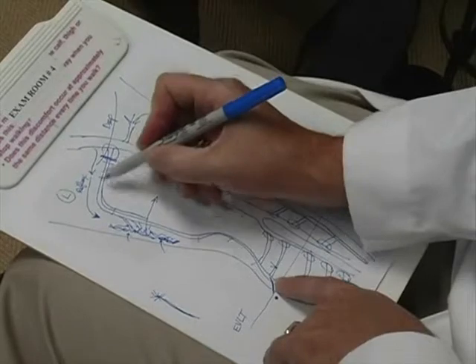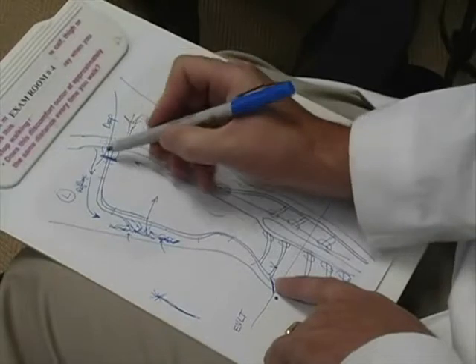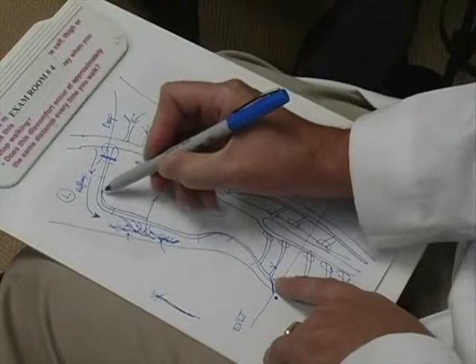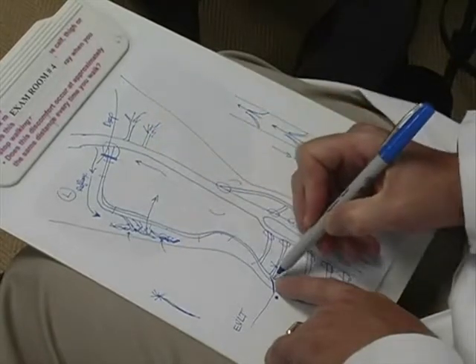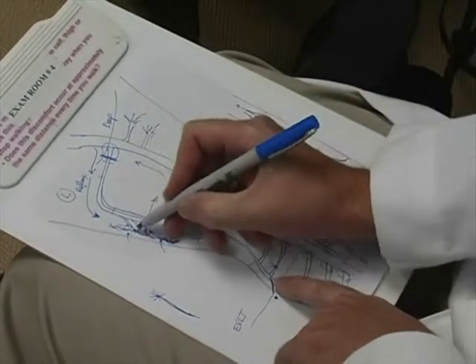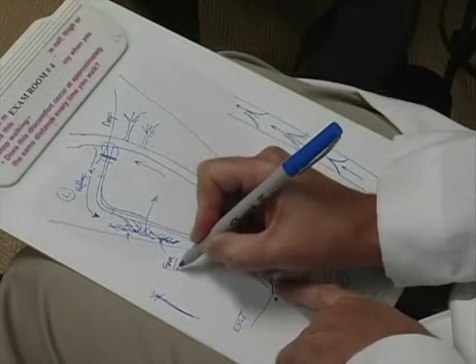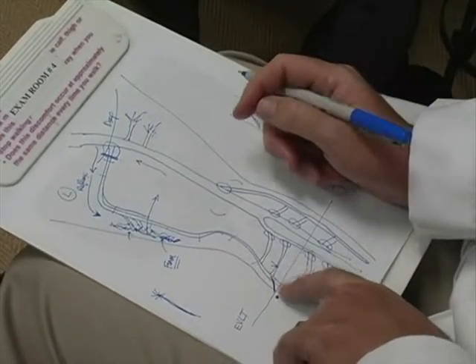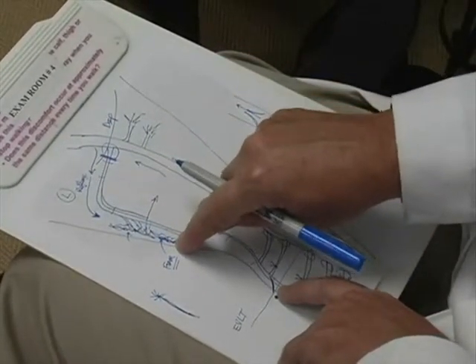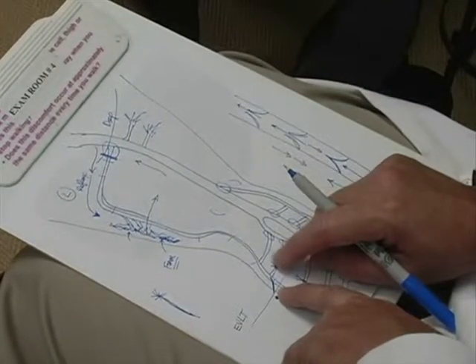We then numb this vein up, 4 or 5 little injections to completely numb the vein. Then using high intense laser energy, we seal this vein closed. Once that vein is closed and the pressure is off of this system, then we come back to the surface and we inject a special type of foam medication called sclerovein. Between the laser treatment and the sclerovein, that's how we get good results as far as closure of varicose veins.